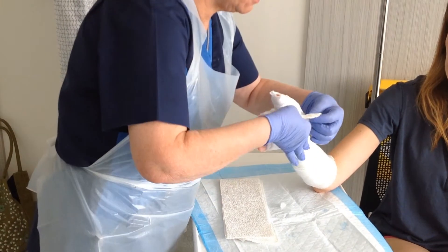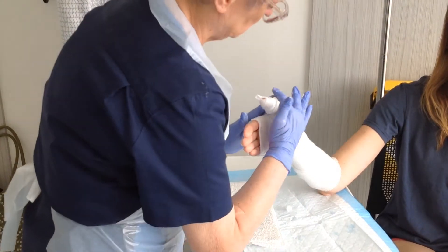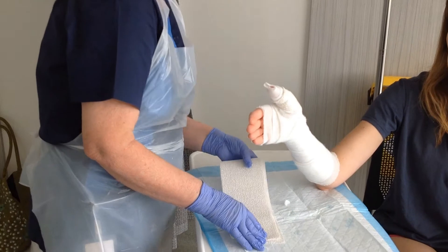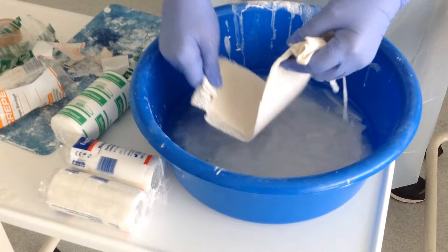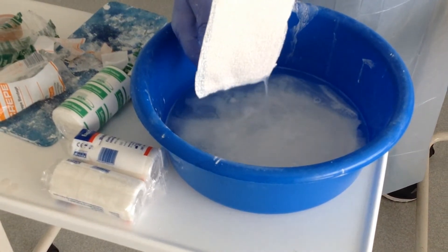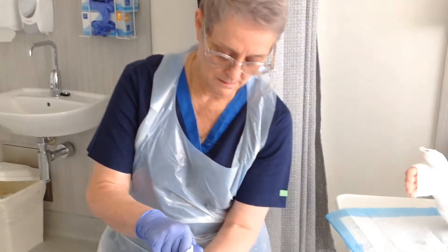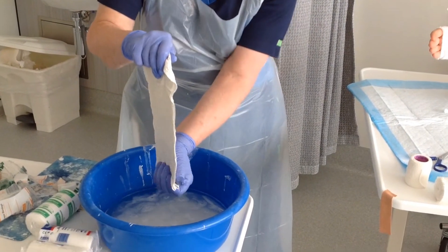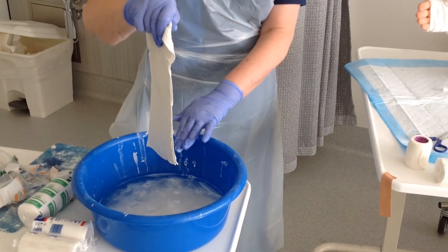Just smooth that down — not too tight, don't pull it too tight. That goes over the plaster. We then take the next piece and give it a quick dip in the water; we don't want it too wet, we just need it to set. Plaster usually takes a full two days to fully set, so the wetter it is the longer it's going to take. Just make sure there are no creases and remove the excess water.